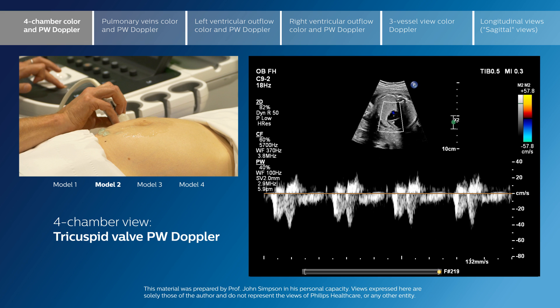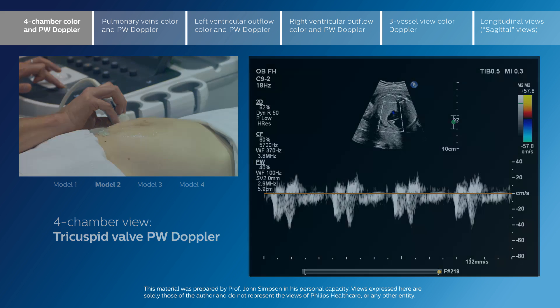To see a single spike of inflow across either one of the AV valves in the normal fetal heart is something which should raise concerns that there may be an underlying structural or functional problem affecting the fetal heart.